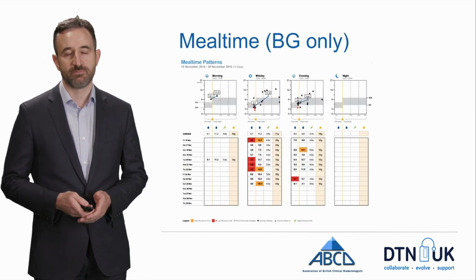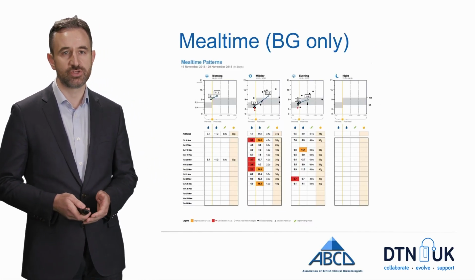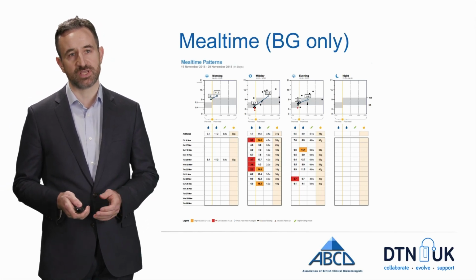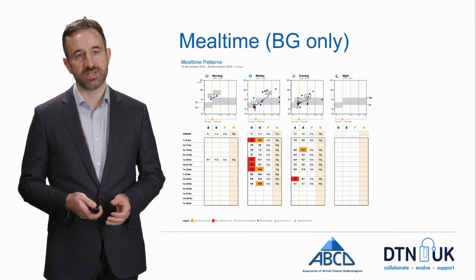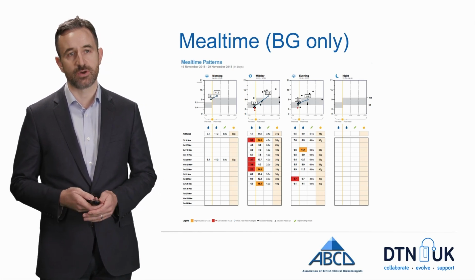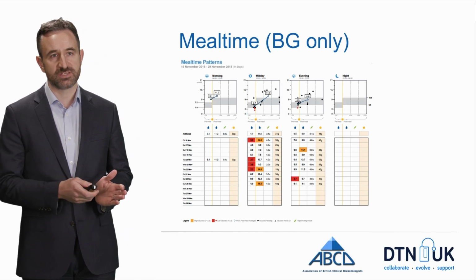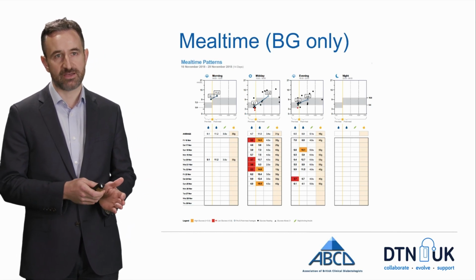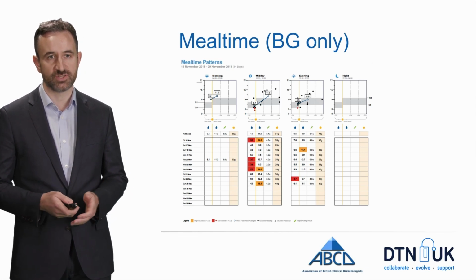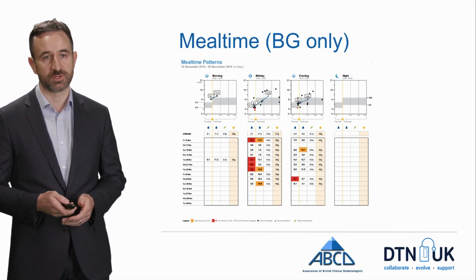This mealtime patterns page is really only useful in people who are still doing finger prick testing, because unfortunately it doesn't actually utilise Libre data, but only finger prick glucose testing data. But if that's something you are doing, then it gives a nice indication of whether there's a rise after meals and whether anything needs to be addressed in terms of carbohydrate counting and meal dose adjustment.